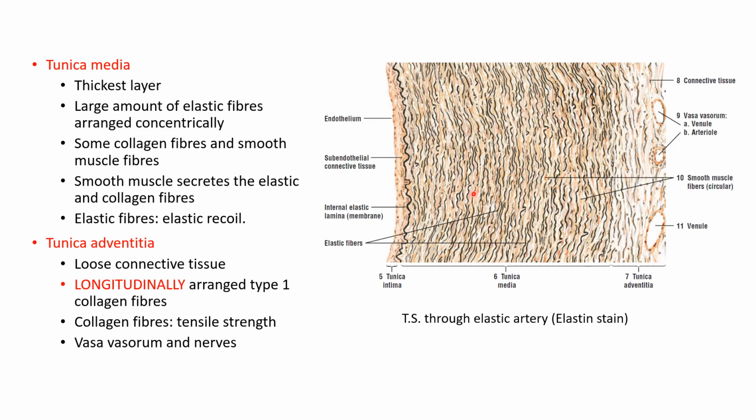The smooth muscle cells present in this layer actually secrete all these elastic fibers and the collagen fibers. These elastic fibers are basically responsible for the elastic recoil of this elastic artery.